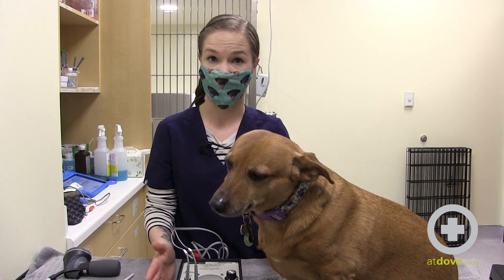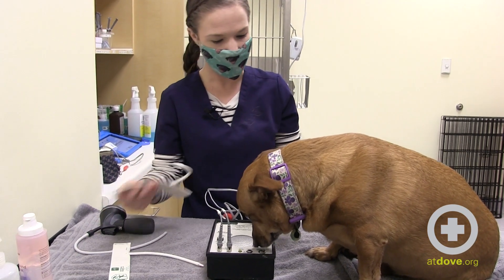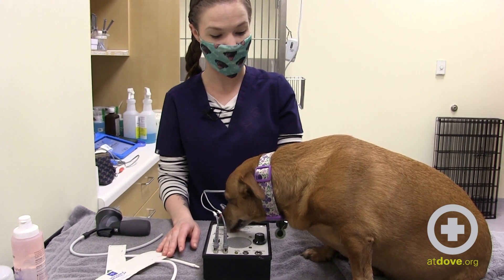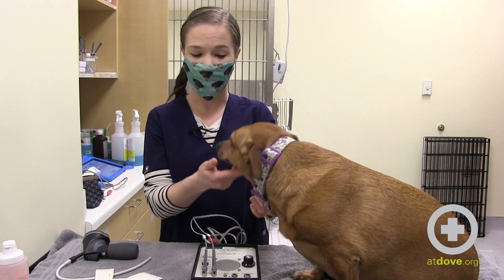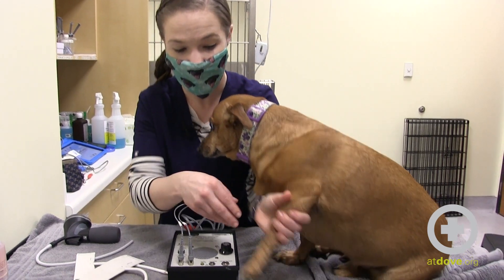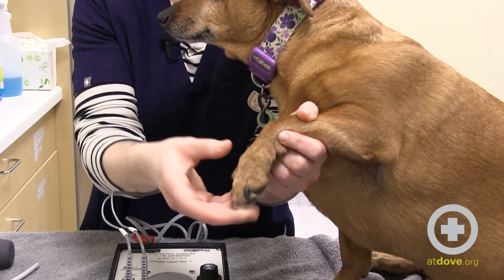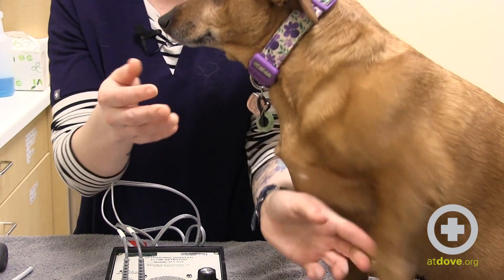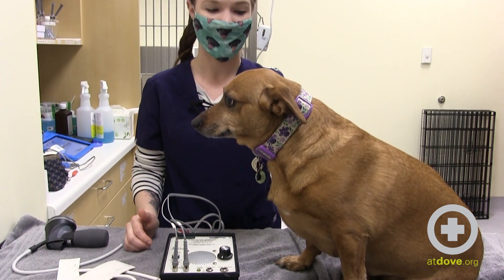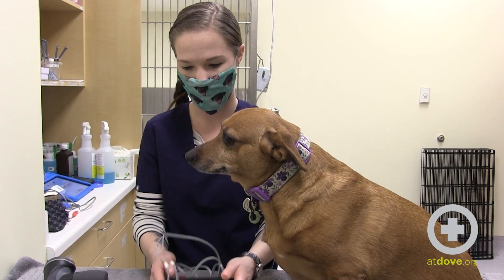That can be attributed to a lot of different things. First, we want to make sure that we're getting the proper cuff size as we're setting this up. You can take the pressure from any of the limbs — the vessel on the underside, the dorsal pedal on top, or the tail. We're going to use Penny's front left leg. We also have already pre-shaved, and that is one of the common issues when you can't find the blood pressure. You want to make sure that you have a nice clean shaved spot. Oftentimes you can get away without shaving with just alcohol on the really shorter-haired dogs like Whippets, but if you're not able to find it, it may just be that you can't get through the hair. So make sure we have a nice clean spot to put our crystal on.